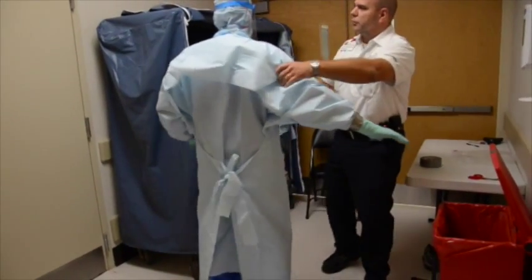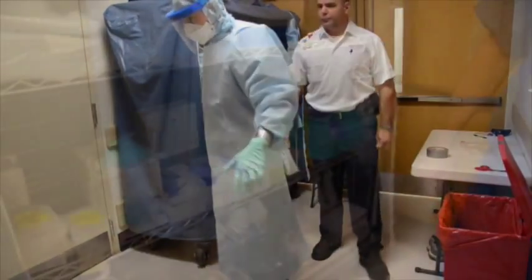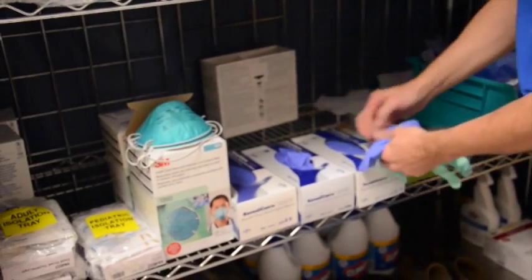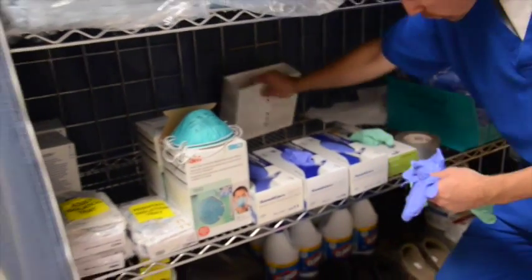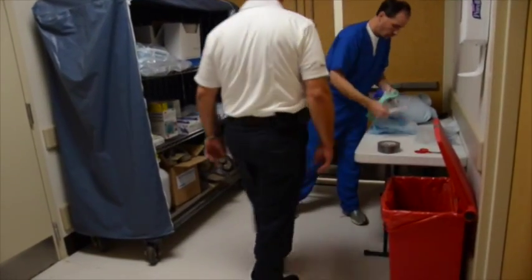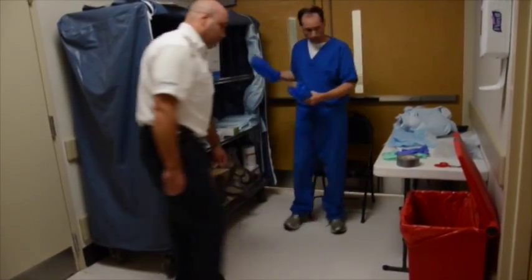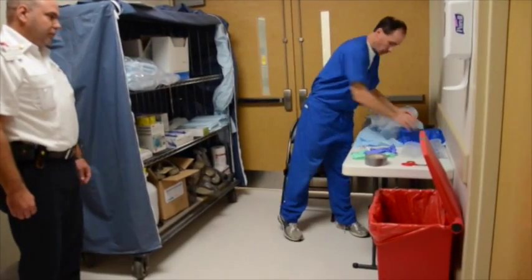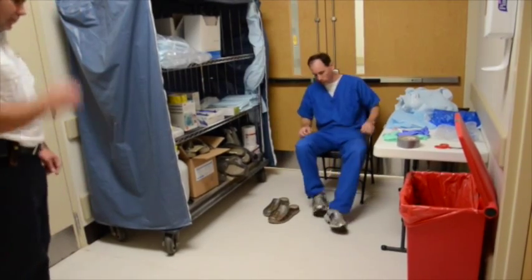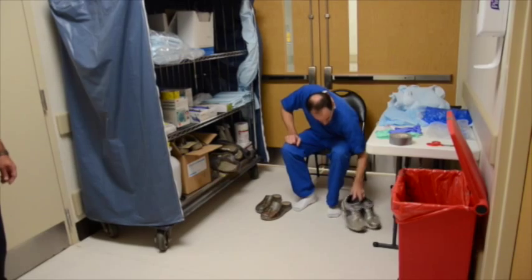Prior to reporting, take and record vital signs with assistance of buddy: blood pressure, pulse, respirations, and body temperature. Be sure to be well hydrated. Assemble all personal protective equipment required before beginning donning procedure. Remove all jewelry and personal items and restrain hair as needed to avoid contamination.